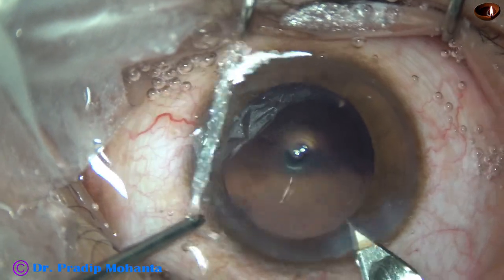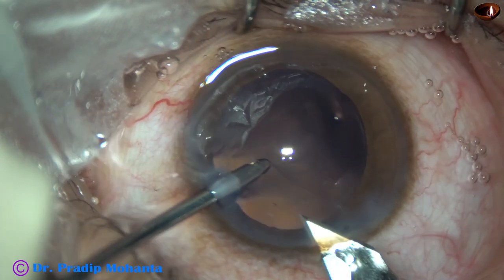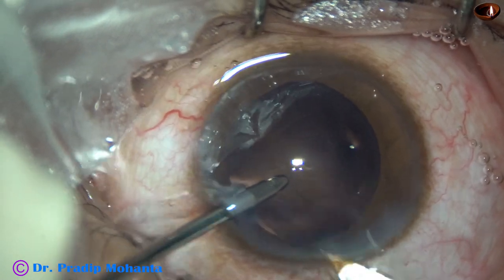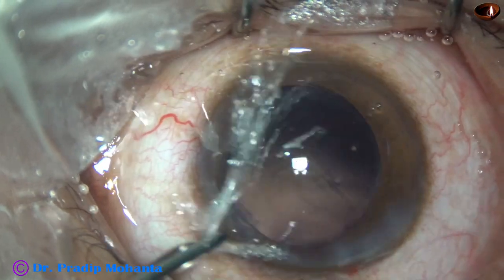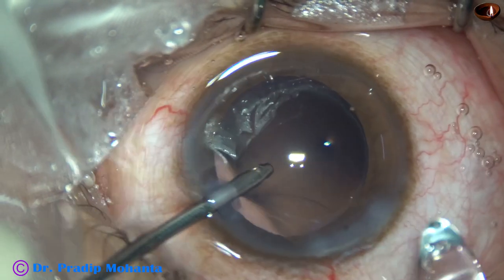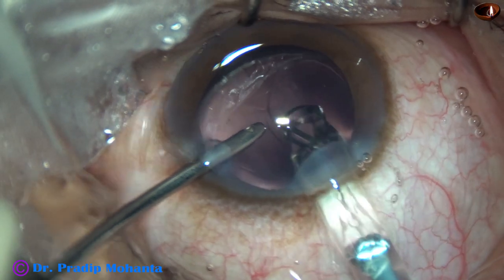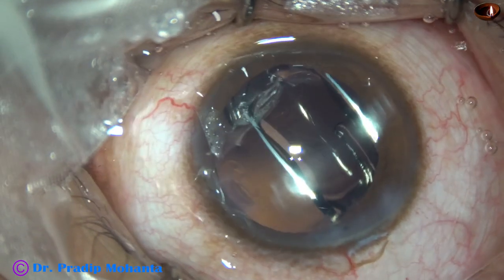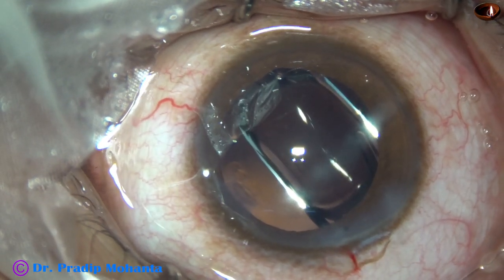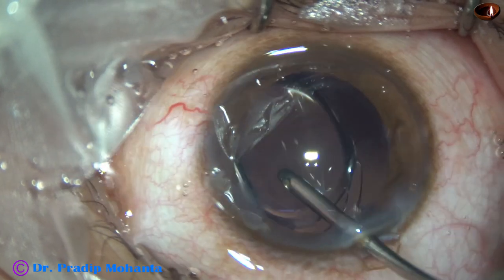The main wound is enlarged a little bit. A single-piece monofocal aspheric intraocular lens from Johnson & Johnson is being implanted — this is the Tecnis 1. No financial interest.